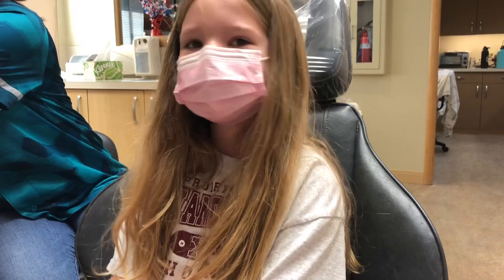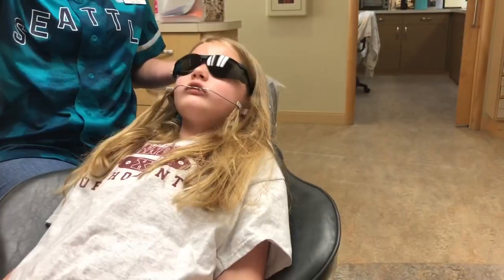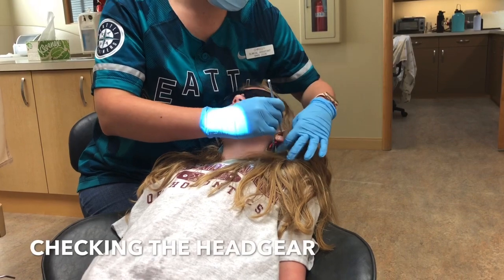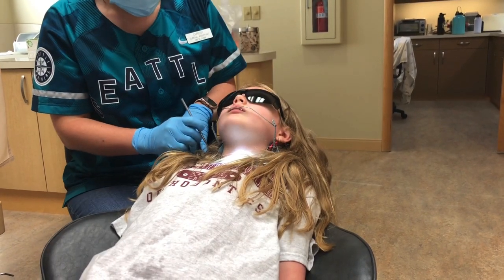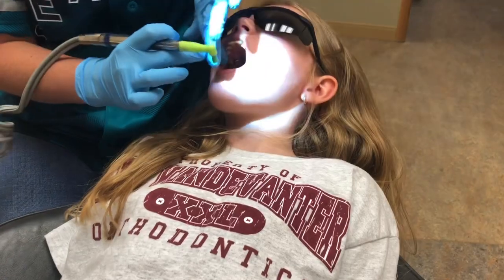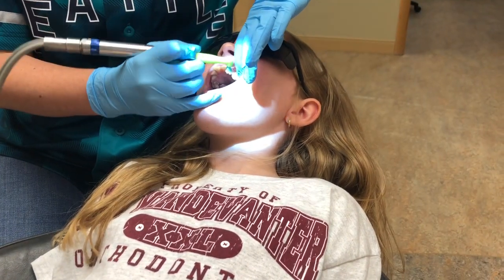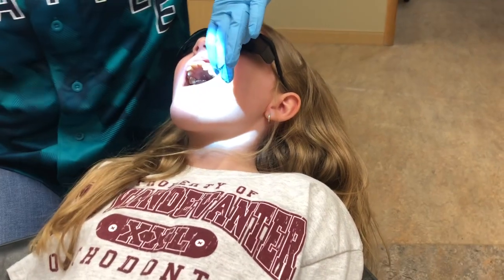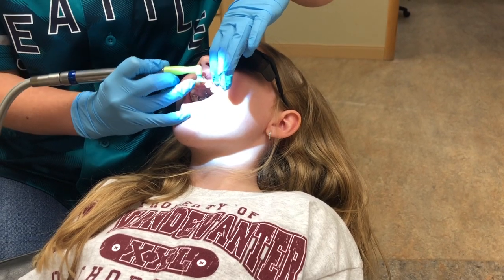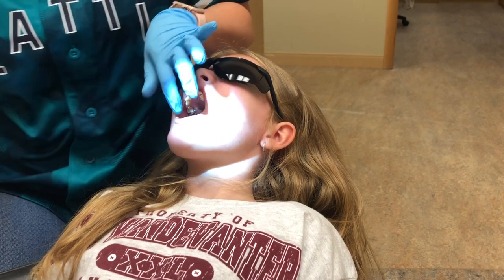Are you nervous? No. Okay. You waited a long time to get these, huh? So she's only getting them on the front? Yes. That's good. That's kind of what I thought. So you don't even have to have them on all your teeth, okay sweetie? She's got some baby teeth in there. We're only using two baby teeth and those are as anchors.